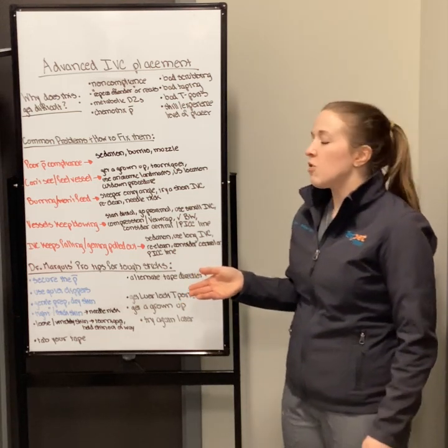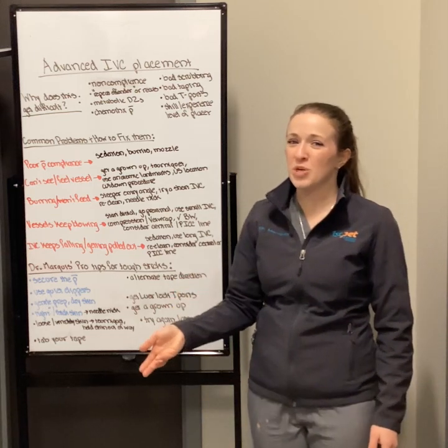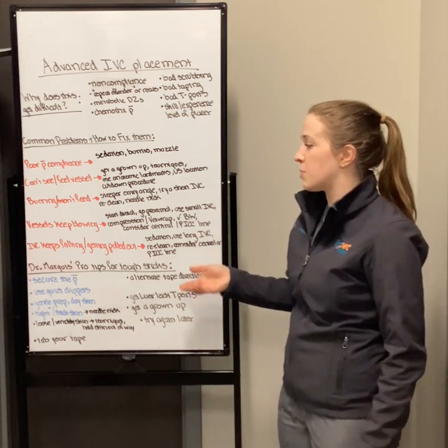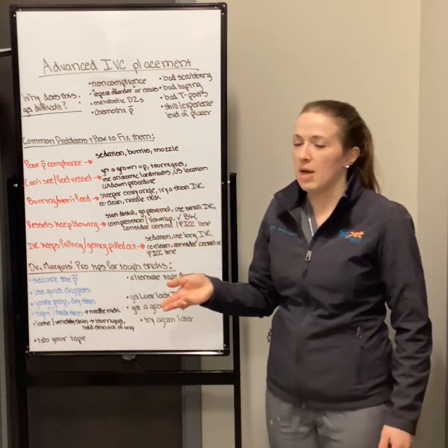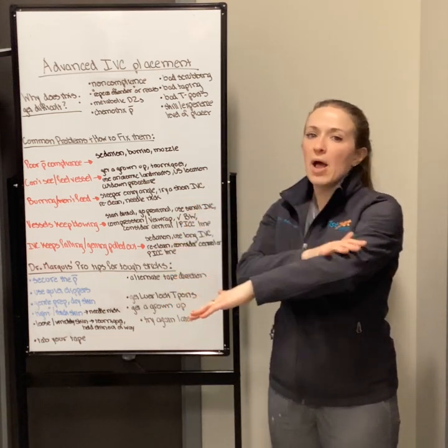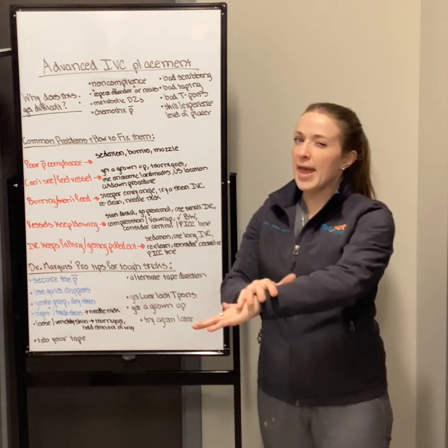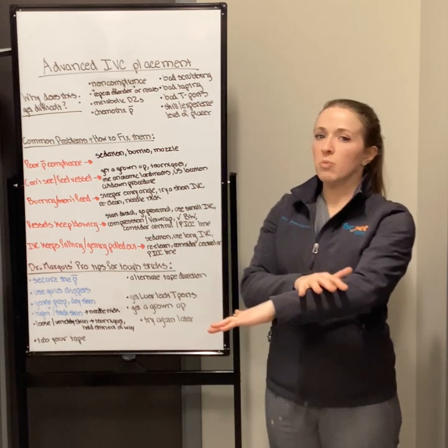My best advice for this is to try to prevent it before it starts, which is tough if you've already gotten too late in the process, but start distally and go proximally as you get more advanced. If you think about the dog leg, with the paw, the antebrachium, and then the elbow, I would recommend starting closer to the bottom of the leg, near the accessory or the bottom of the cephalic, and working your way up.